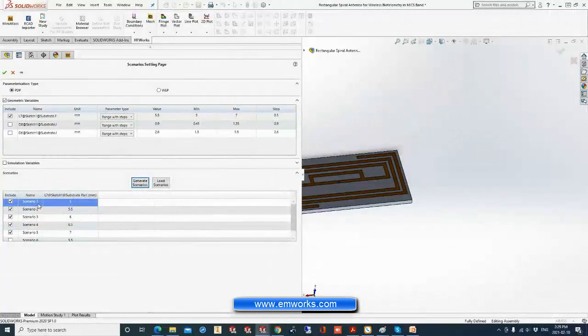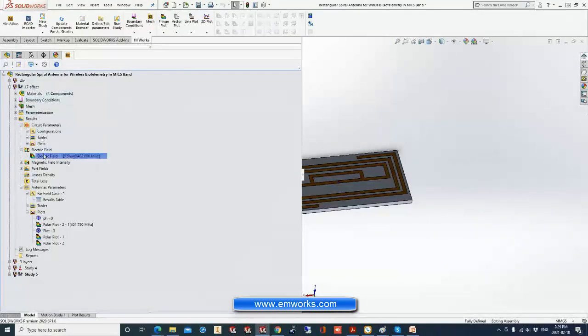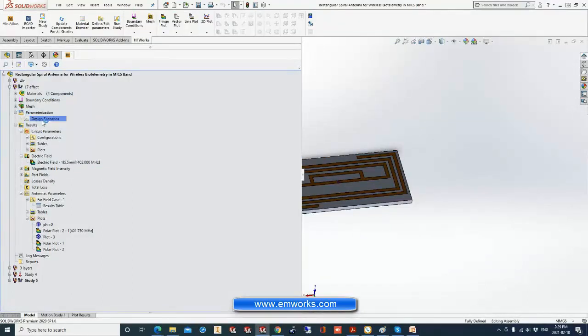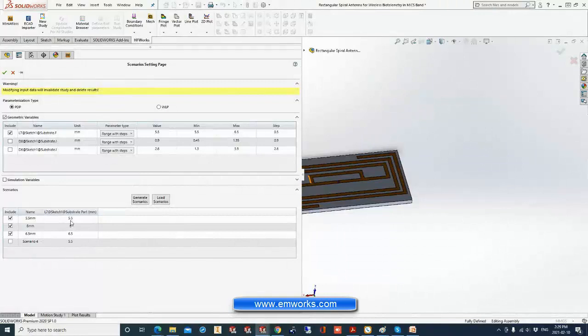I can rename the scenario name. Also, if I don't like a value, I can simply type the new value here, and automatically the software will adjust the geometry according to the requested dimension and give you the results with the new design. Let me share with you here. I already solved the problem using the same length. I defined here 3 scenarios going from 5.5 to 6.5 millimeter.